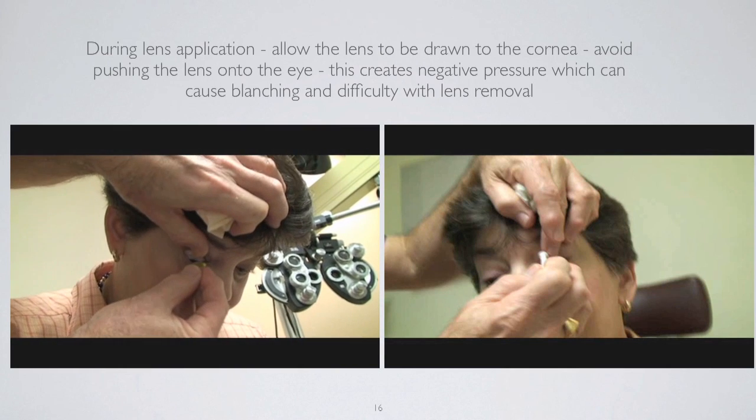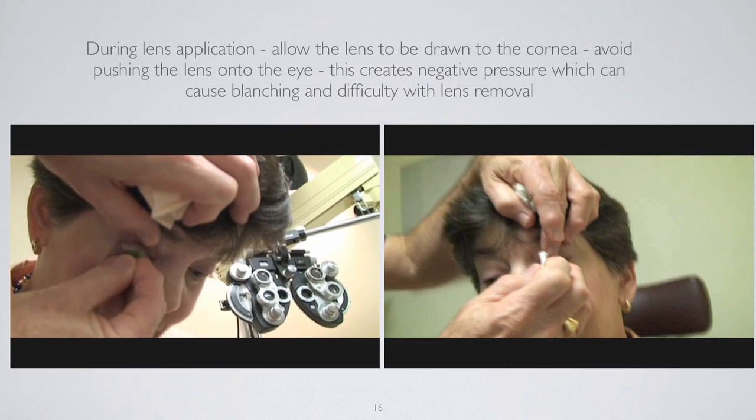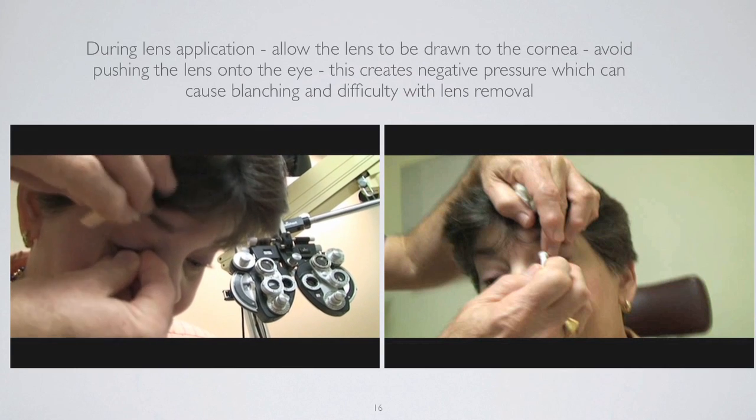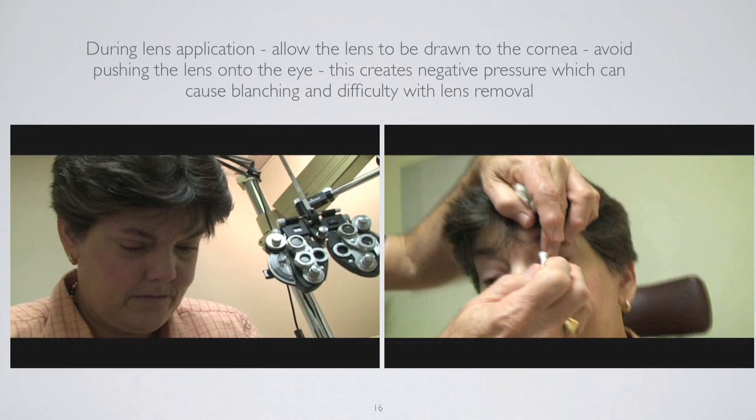I have the patient look directly down at the floor. I retract the upper and lower eyelids, and here I'm using the tripod method — my three fingers holding the lens. I place the lens on the eye. Because I have fluorescein, I always have a tissue with me to ensure that anything spilling over doesn't get on the patient's clothes. It might not be a bad idea to have the patient hold a paper towel in their lap, because you're going to get some excess fluid that comes out of the eye.